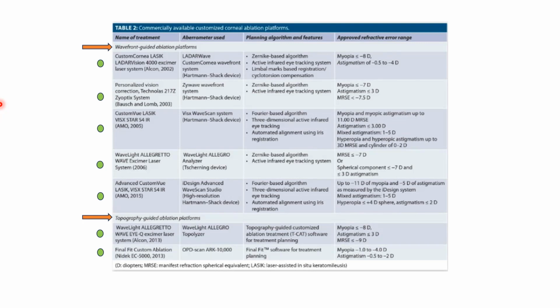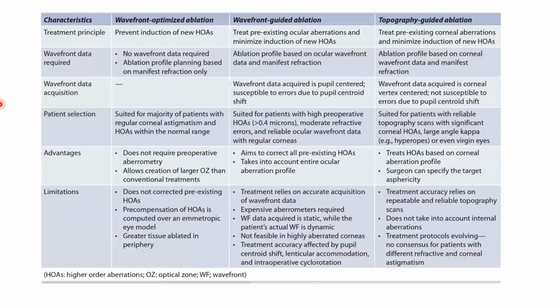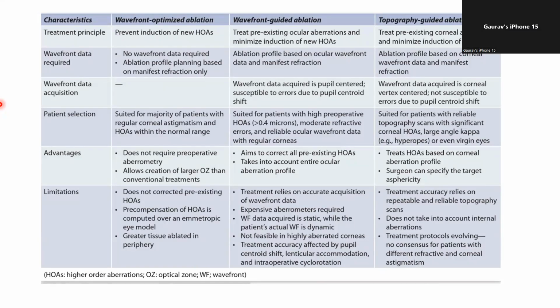Sir, because it offered a more customized treatment. In what way, from the previous program? Because it improves the quality of vision, sir. It reduced glare and halos. Right, but how? How did it reduce the glare and halos? What changed with wavefront optimized?